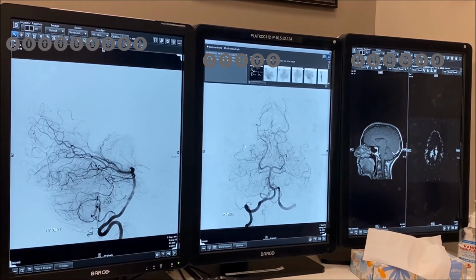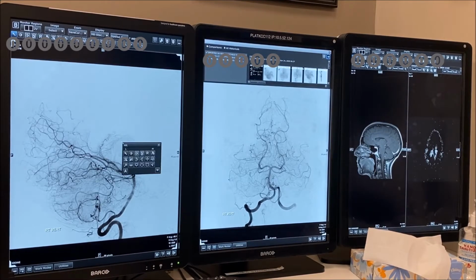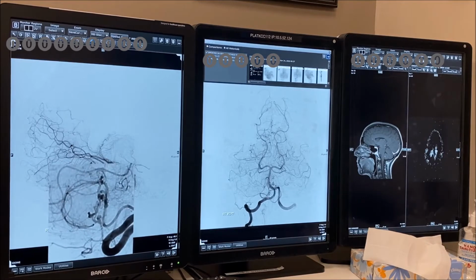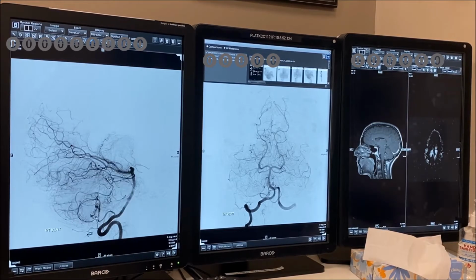So in the region of interest correlating with the MRI, there's abnormal vasculature, which appears to arise from the right posterior inferior cerebellar artery. Although I'm not sure if there's some meningeal supply as well. The artery itself appears dysplastic. It's sort of multifocal fusiform and saccular dilatation. How would you call this structure like that? Let's go and see. They did another view.